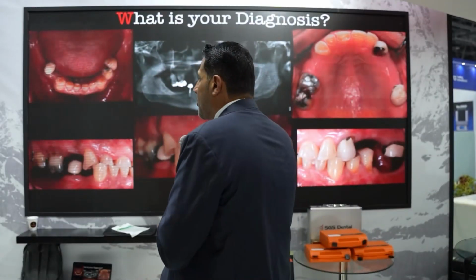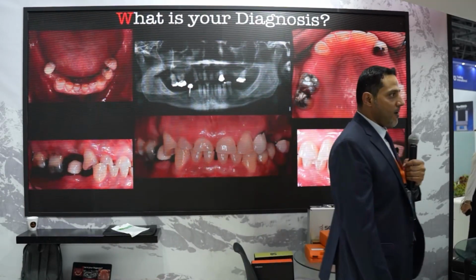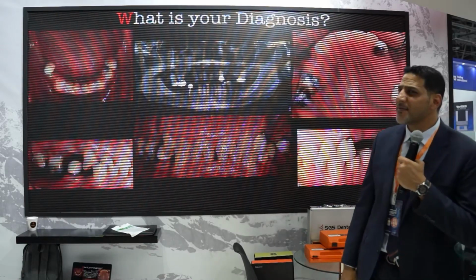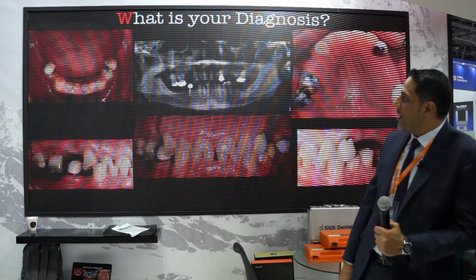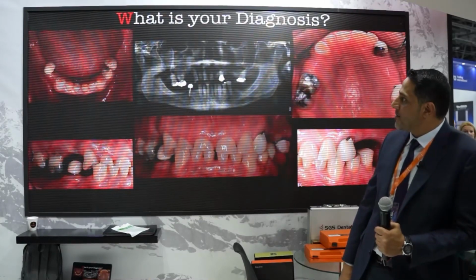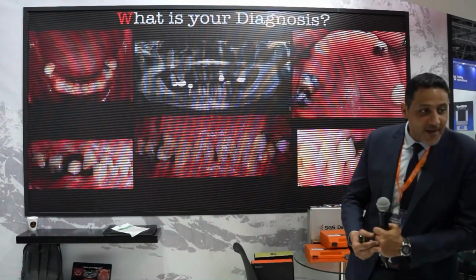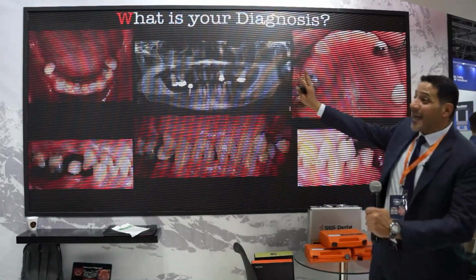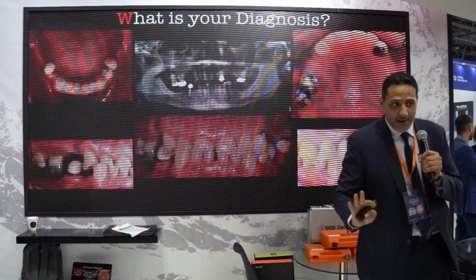I'm talking about diagnosis, not the treatment. Yes, what else? Generalized periodontitis. This needs a CBCT because... No. I'm talking about diagnosis only. I am asking about diagnosis, not the treatment plan.